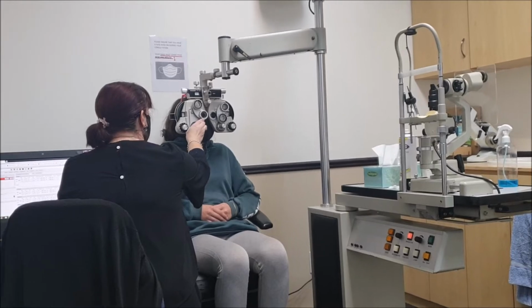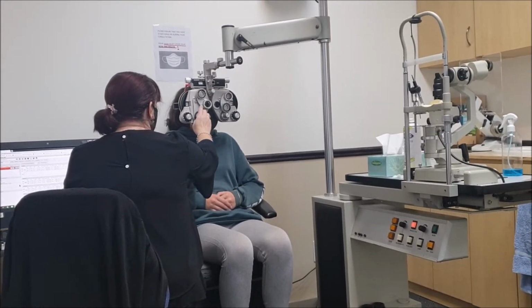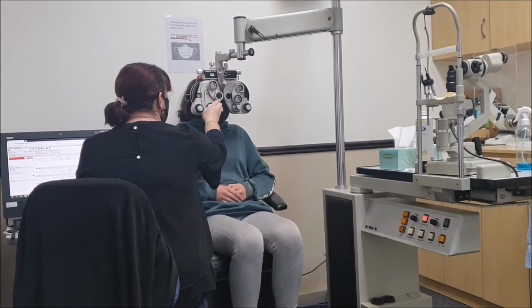Then she flipped a switch on her side, which I couldn't really see what she was doing, but it changed what was in front of me. It made the magnification more or less and stuff like that. And then she asked me, can I see clearer with this or without this? And then could I see clearer with this one or with that one? So it was a lot of that cliche: do you see better with one or two? One or two? Kind of went back and forth. Now definitely a few times I was like, there is no difference here, what the hell? Which in itself is an okay answer. You can tell the person, well, they look really similar, but I guess this one more than that one.